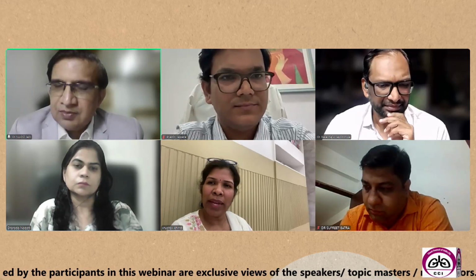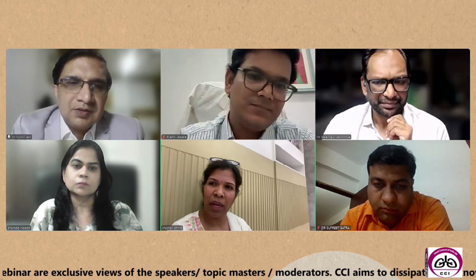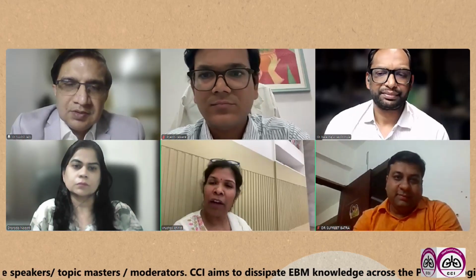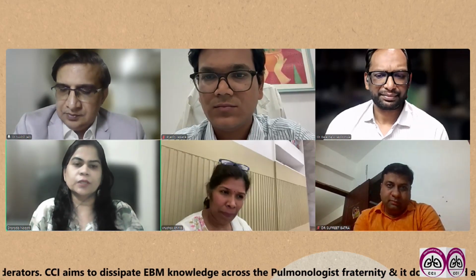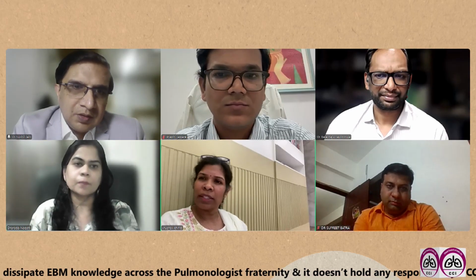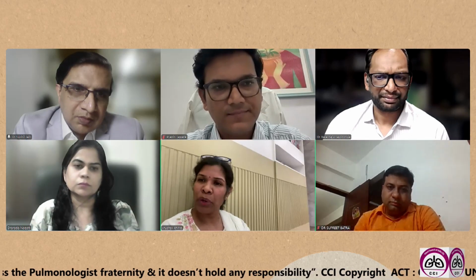Can I just pitch in, sir? Can we ask Dr. Sharada, with these small needle sizes, how does flow cytometry compare, has she seen a difference between the intranodal forceps biopsy and flow cytometry if there are enough samples received, particularly for lymphoma? Not the needles. Dr. Balaraju said he is doing the intranodal forceps biopsy and a cryobiopsy, which has been proposed for both sarcoidosis and lymphoma.